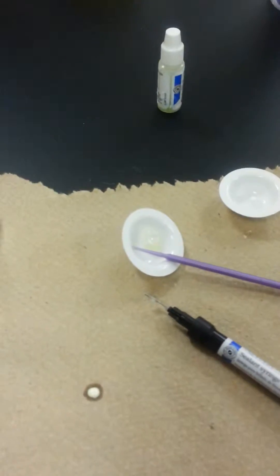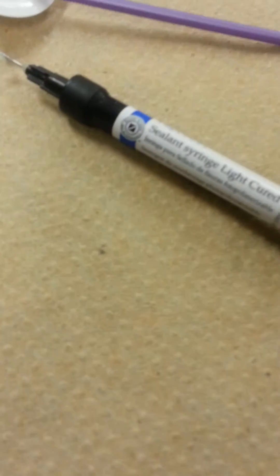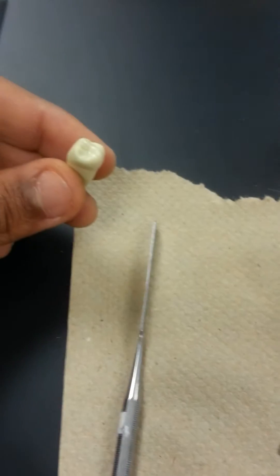Alright, I'm doing the etching and the sealing of the tooth. I have my etching syringe, my sealing syringe, two brushes, a dappin dish, and my tooth.